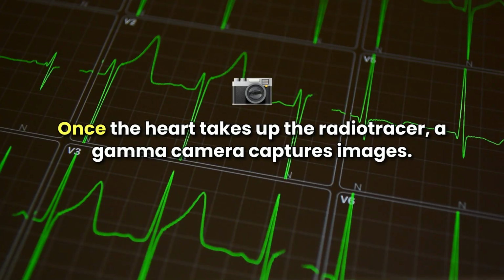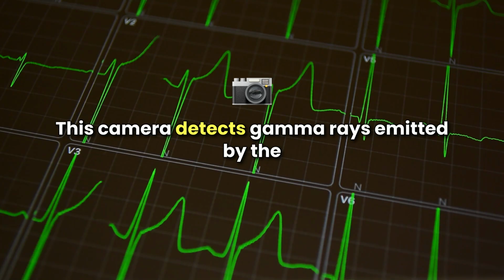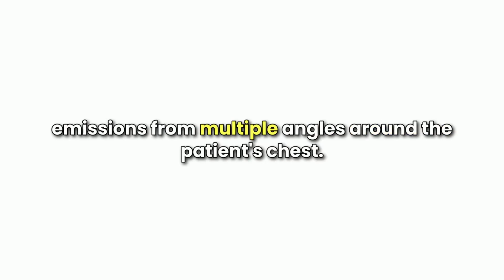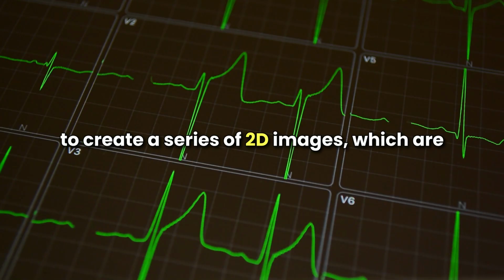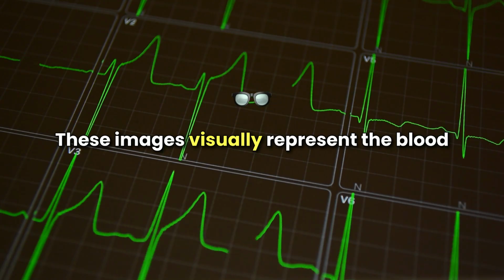Once the radiotracer is taken up by the heart, a gamma camera is used to capture images. This camera detects gamma rays emitted by the radiotracer as it decays and captures these emissions from multiple angles around the patient's chest. The data collected by the gamma camera is processed to create a series of 2D images, which are then reconstructed into 3D images of the heart. These images visually represent the blood flow distribution within the myocardium.